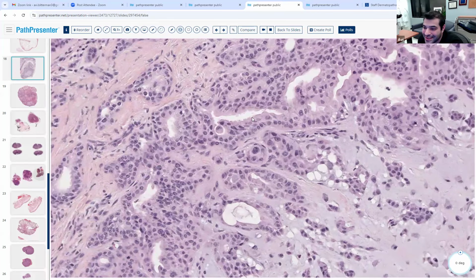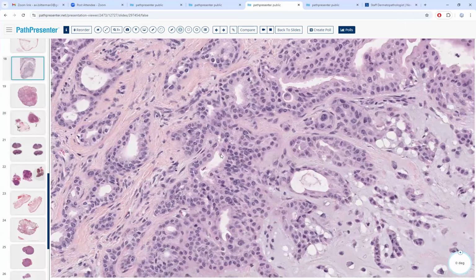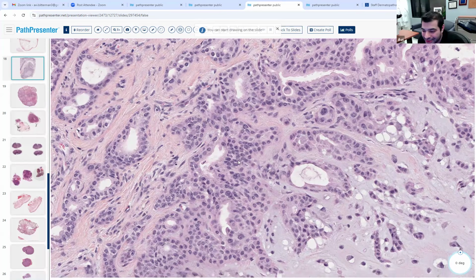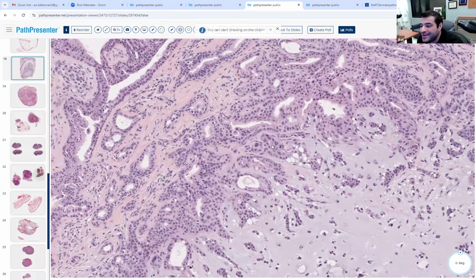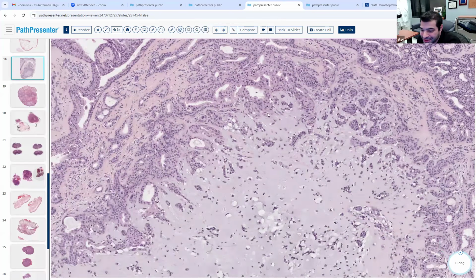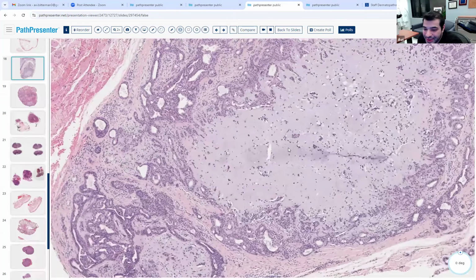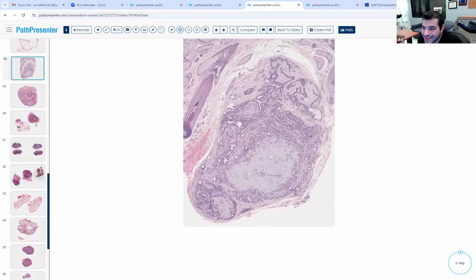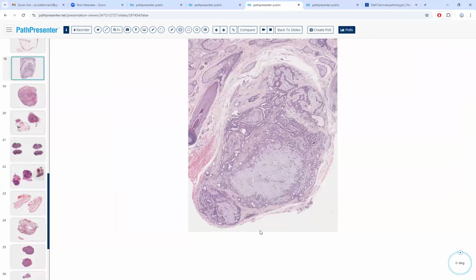In this case, which one do you think it is? This looks like an eccrine component, eccrine gland. Not apocrine, correct? I'm not quite sure. Apocrine, yeah, apocrine. So okay, good. So you point out there's an epithelial component. There's a lining. So biphasic, there's an epithelial component, there's a myoepithelial component, there's a stromal component. Good. And again, do you think this is benign or malignant? Benign. Benign, yeah.